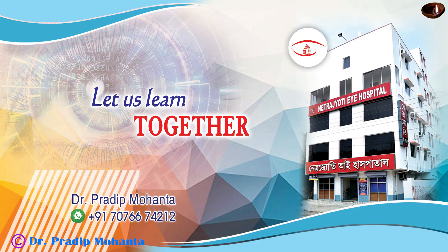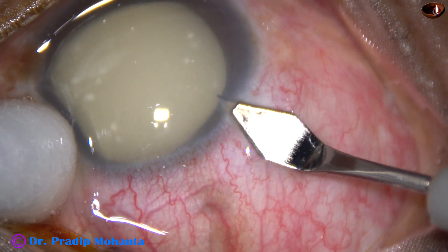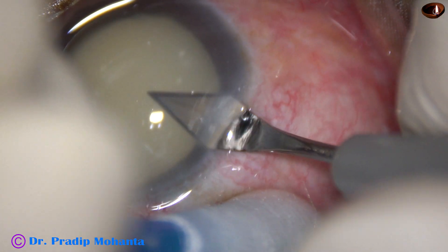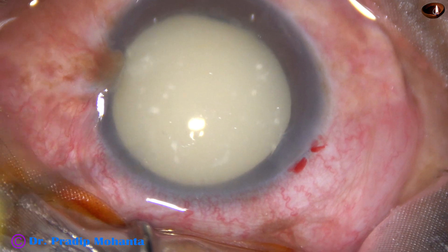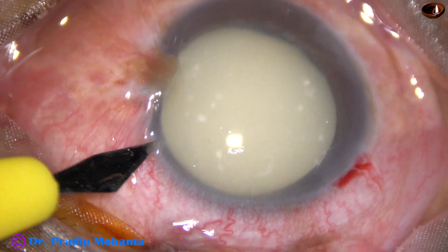Friends, let us see management of a hypermature Morgagnian cataract. This patient came with very high intraocular pressure — between 60 and 70 mmHg. With medications, the pressure came down to 34 mmHg, and then I have taken up this case for surgery. Let us observe this surgery. The zonule is very weak in this case.